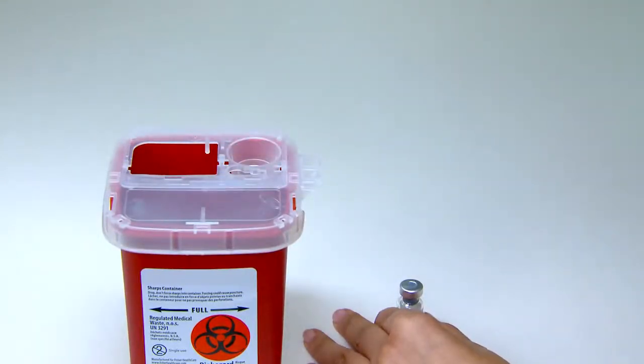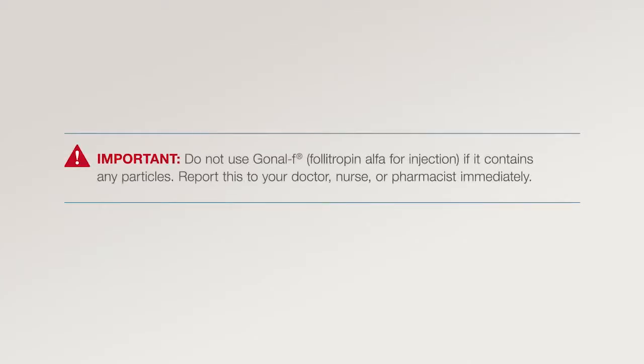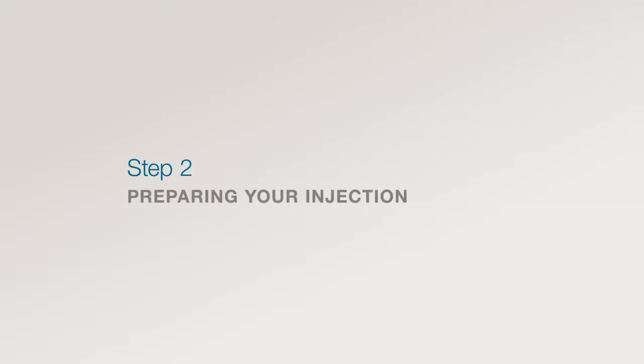Do not use this needle and syringe to inject your dose. It is important to note that you should not use Gonal-F if it contains any particles. Report this to your doctor, nurse, or pharmacist immediately. Step 2. Preparing your injection.